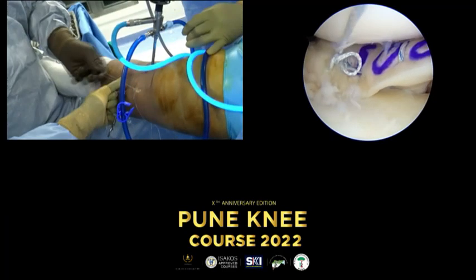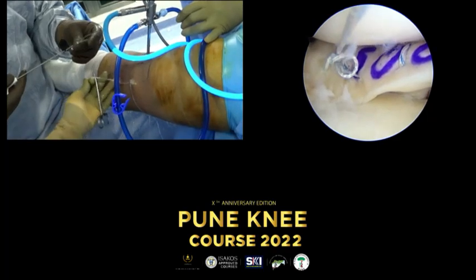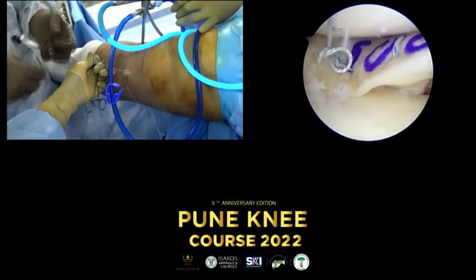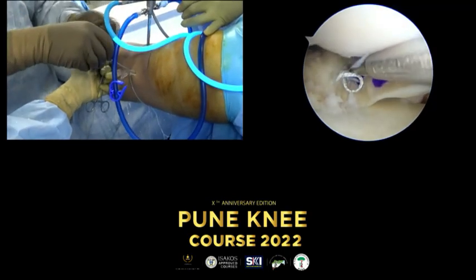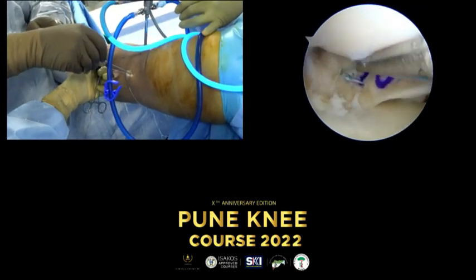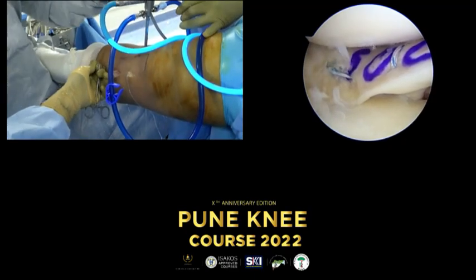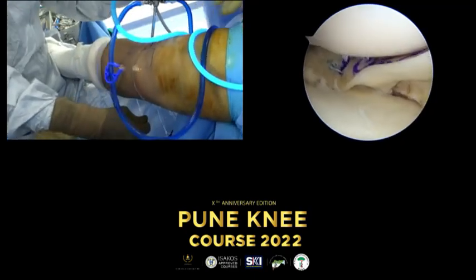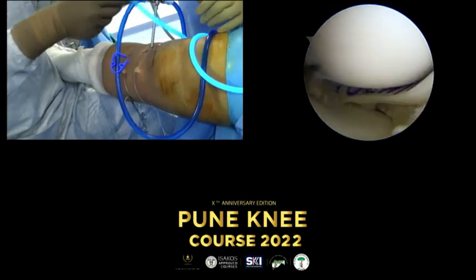Okay. I think we are almost done with the all inside repair. Probably one more in the mid body, but we do it later. Okay, I'm happier with this. Good. This is here. It's a little bit high. Okay. Now I will do this.